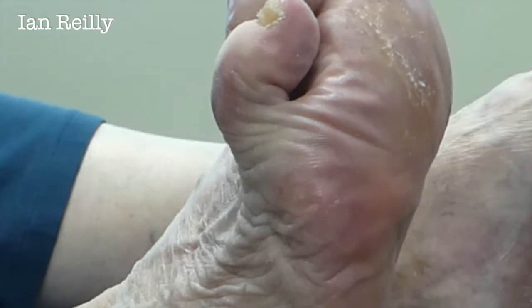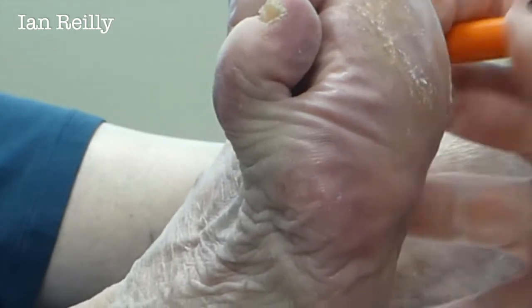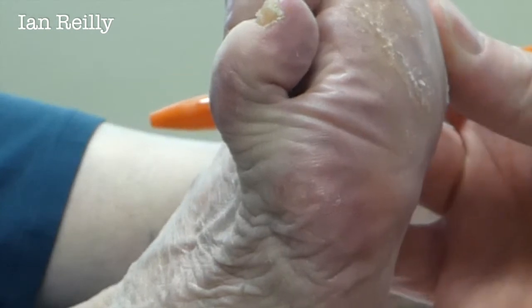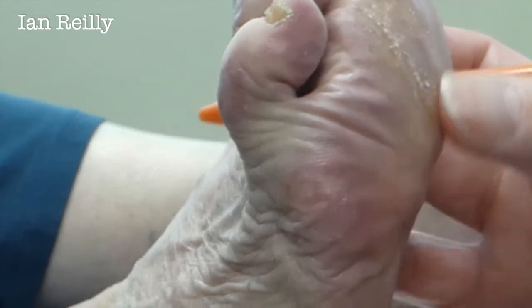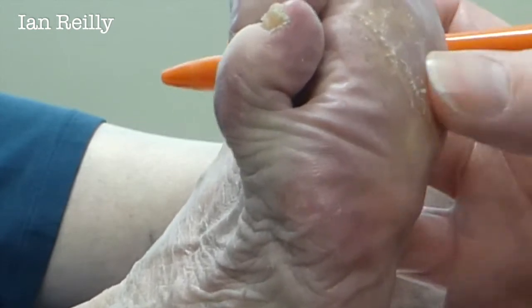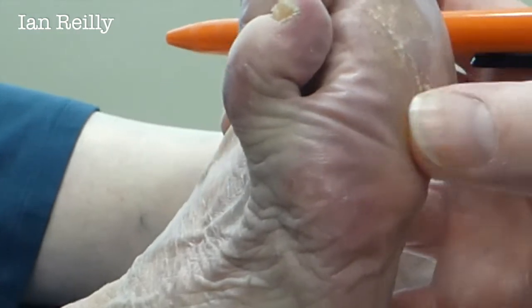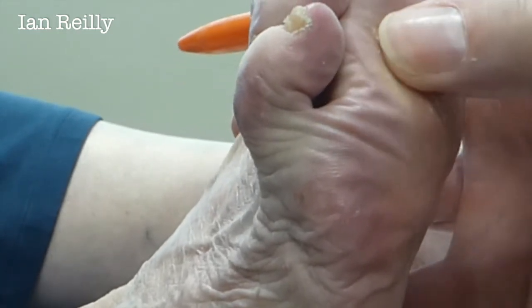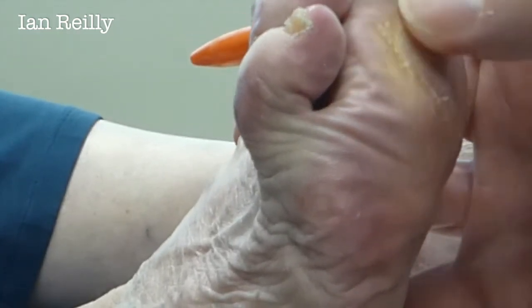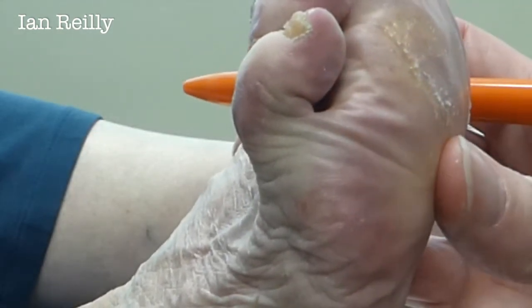You can just see on the side of the camera there's just very, very little between the skin and the bone there — a little bit over two, a little bit over one, but particularly this lady's very sore. Christine, particularly here isn't it — three and four were really quite skinny. So the whole of this area needs some filler putting in.